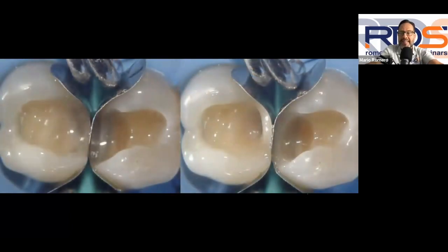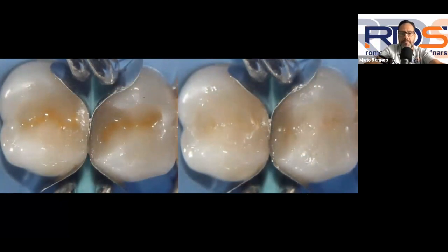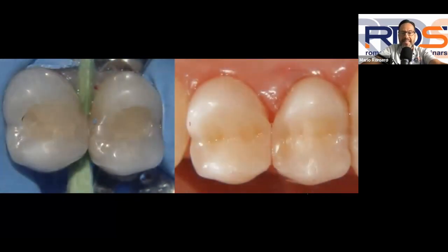Again, once you do that, the first thing that I always recommend doing is going back and restoring these proximal walls first. Make sure that you have both of your proximal walls so that you know, okay, once I have taken these preparations from a class one to a class two, from there on, it's just a basic class one that you're going to restore. That's what you're seeing here on the left, on the right-hand side. I already have my mesial wall, the distal wall of that first premolar restored. And then I'm going to go ahead and do the same thing for the second premolar. Then I go into the occlusal anatomy and I literally finish my preparation. And that's what you're seeing there.